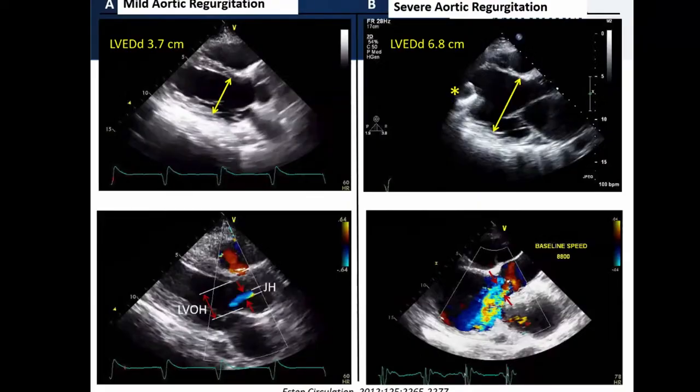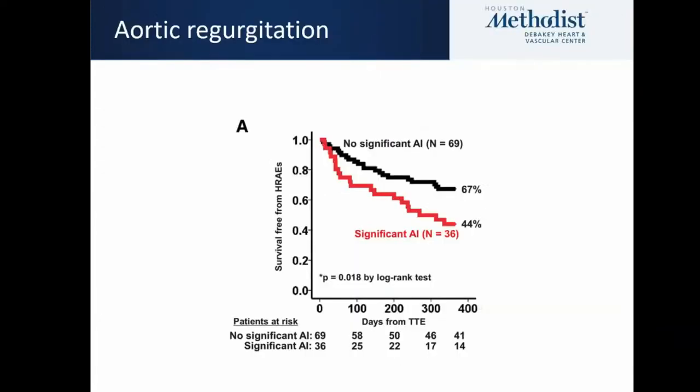There is definitely then a role for considering TAVR or surgical aortic valve closure or replacement in patients who have an LVAD. But we have to be very wary of how we quantify the aortic regurgitation, as these procedures are associated with a lot of complications, and they're not as easy as in patients without LVAD. As I mentioned, even in the newer population and data, significant aortic regurgitation is associated with significant hemocompatibility-related outcomes, including worsening GI bleeding, more strokes, even more pump thrombosis.